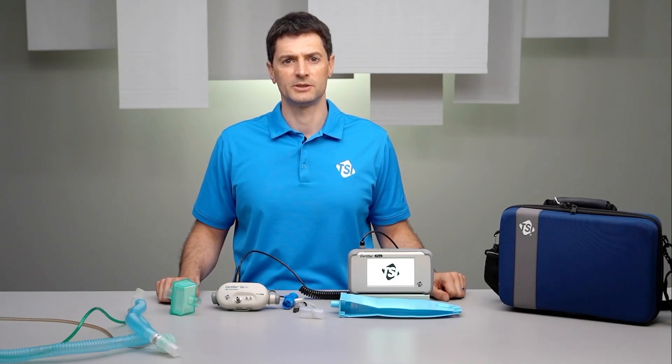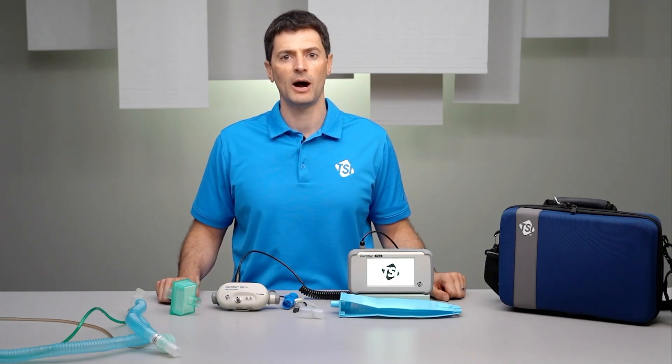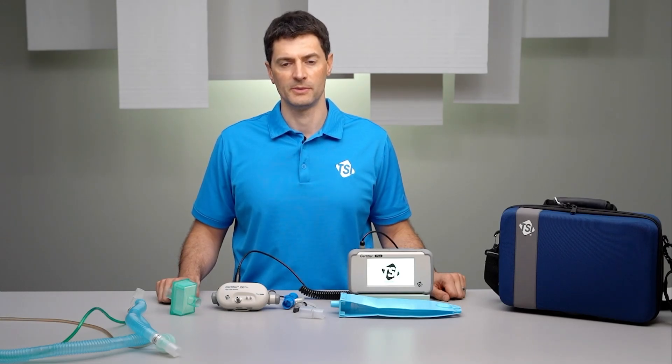Power can be supplied to the Certifier Plus using the AC power adapter or from its internal battery. After the instrument boots, wait one minute for the sensors to warm up before taking measurements.